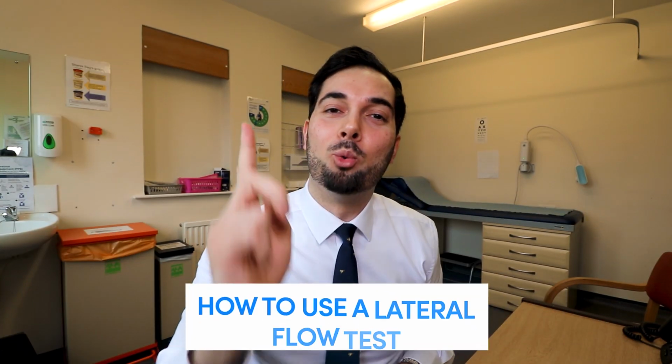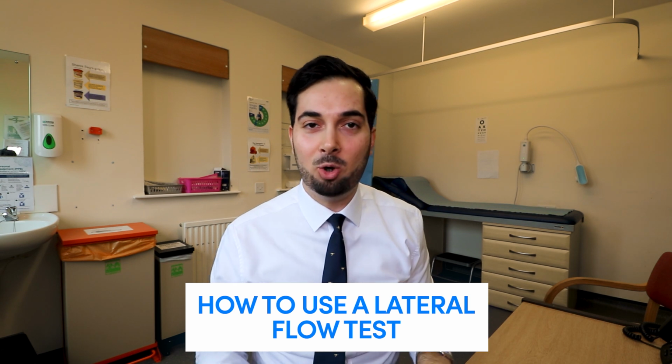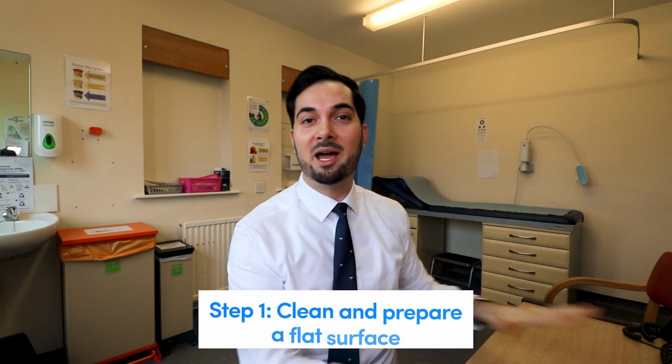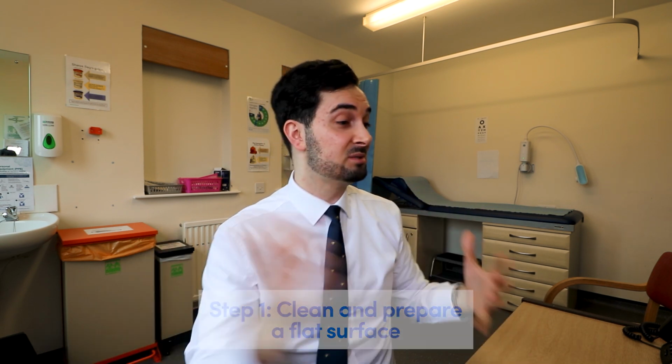Okay, so step number 1, before we start doing anything, before we open our test kit and get everything out, we need to make sure we've got a nice flat area that we can work with, and we need to clean it. We need to get some detergent, some spray, some wipes, whatever you use, and give that area a quick clean, just to stop any contamination, because contamination can affect our results, so you need to make sure this area is nice and clean.